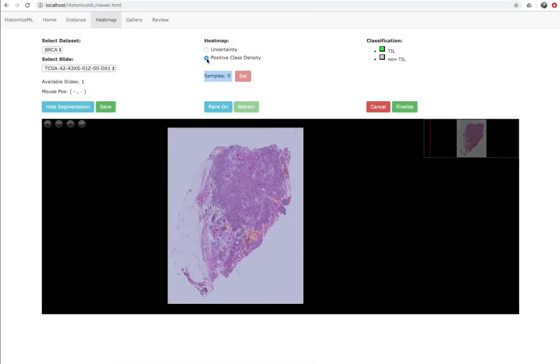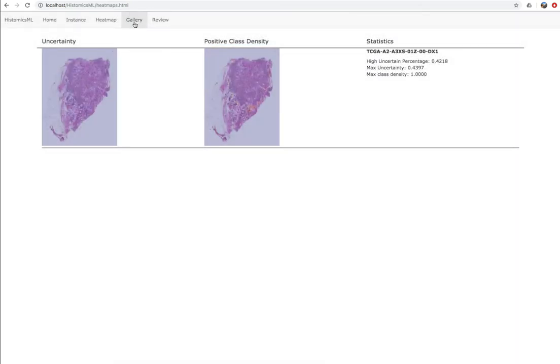The quick start container contains a single slide, but most datasets will contain many slides. To help with labeling, we provide a heat map gallery accessible using the banner link. This gallery organizes the heat maps for each slide in your dataset using prediction uncertainty statistics to help prioritize slides that need additional labeling. Clicking on a slide in this menu will load that slide in the heat map labeling view for exploration.